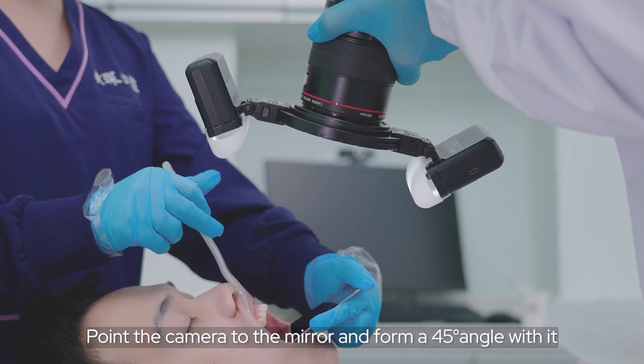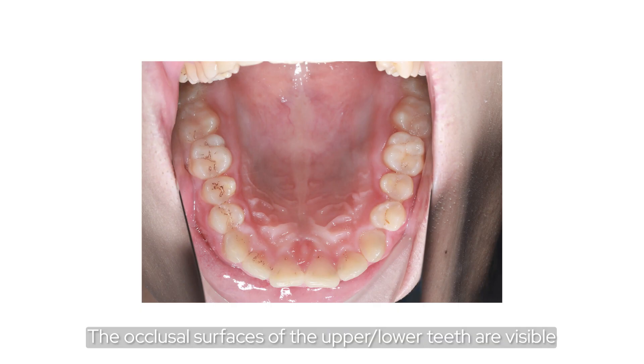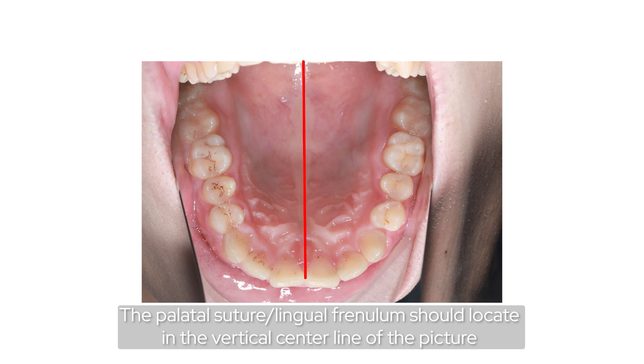From the camera to the mirror, form a 45-degree angle with it. The occlusal surface of the upper and lower teeth should be visible. The palatal suture and lingual frenum should be located in the vertical central line of the picture.